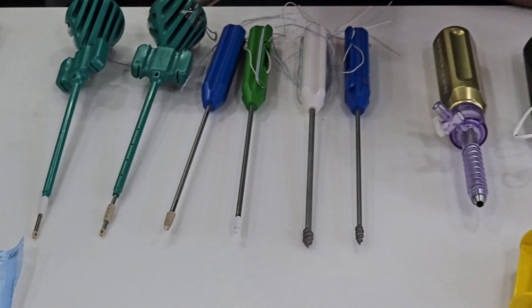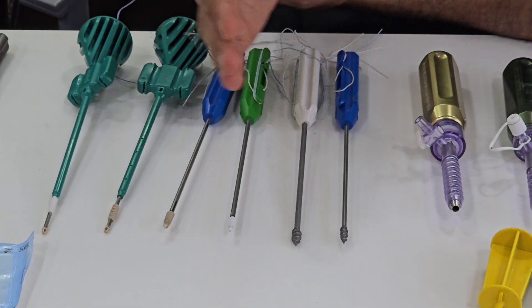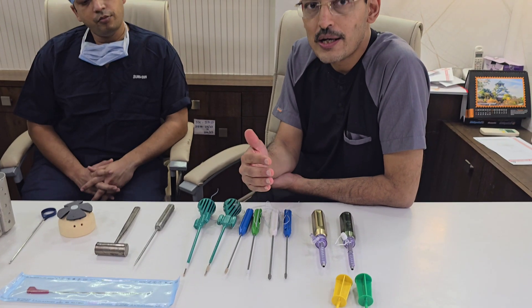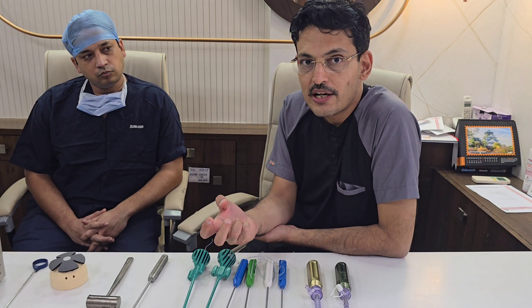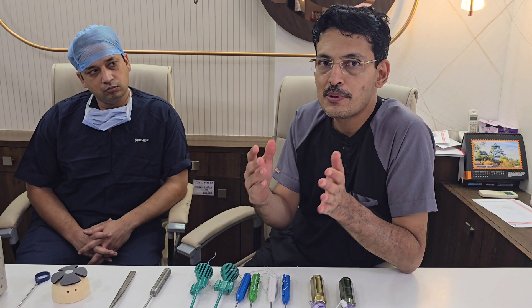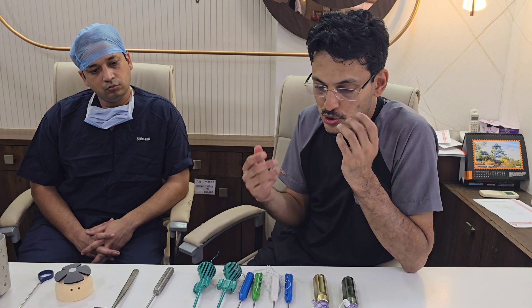You also have double-loaded and triple-loaded options available for all the anchors. Using a triple-loaded anchor is good, but you need to be very vigilant with suture management because there are a lot of sutures inside the shoulder.